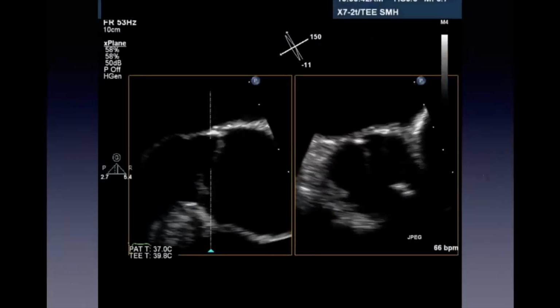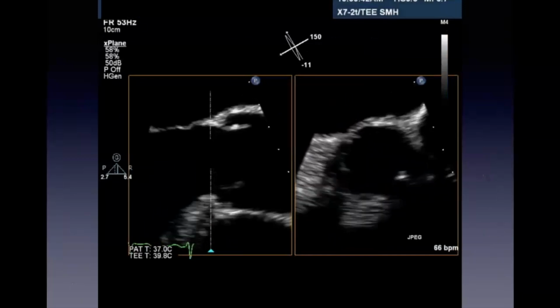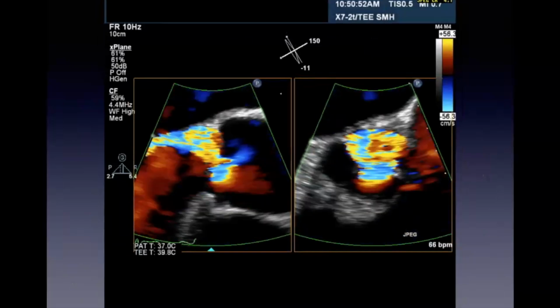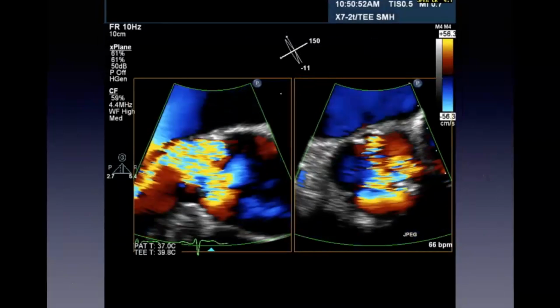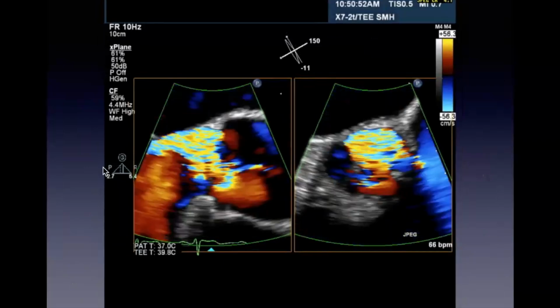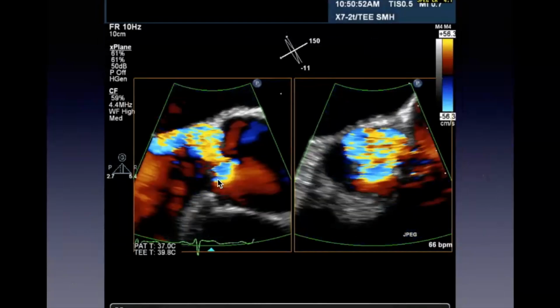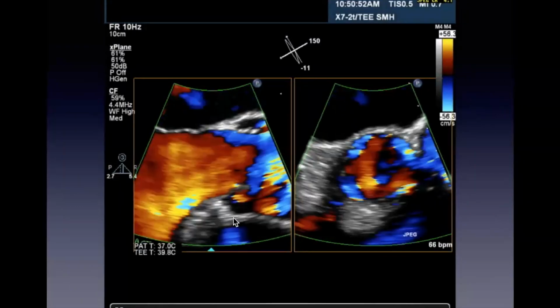So now the patient had a transesophageal echo, and this is X-plane imaging through the aortic valve. You can see that, look at that beautiful flow convergence. That's gorgeous. Now, don't forget, everything is upside down on TEE. So this is posterior, that's anterior.